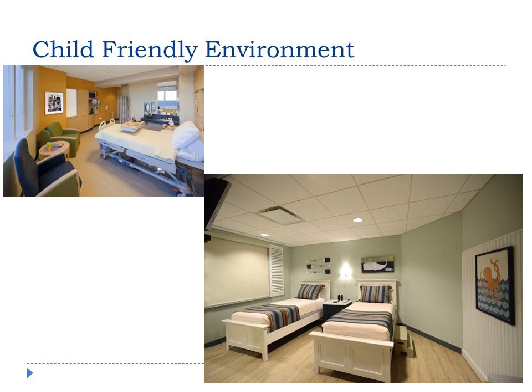Let's take a look at the environment for the pediatric polysomnogram. We really don't want to bring a child into an adult environment and expect them to feel comfortable and be able to have a good night's sleep. So we want to bring them into an environment that is built for them. That means using bright colors, child-friendly design, which maybe is cartoon characters or animals that would appeal to children. With the bed covers, maybe it has a fun decoration on it. Again, cartoon-like things as well.